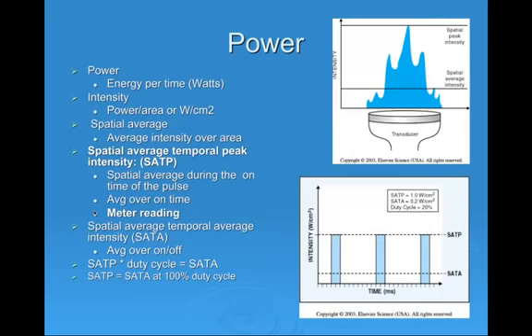So power, lots of stuff here. All right, so power is defined as energy per unit time, and that's given in watts. All right, so the intensity, or what we're dialing into our machines, is usually given to us in that power per unit area, or watts per square centimeter. So as you're turning up the intensity, that's what you're typically reading off of the screen.